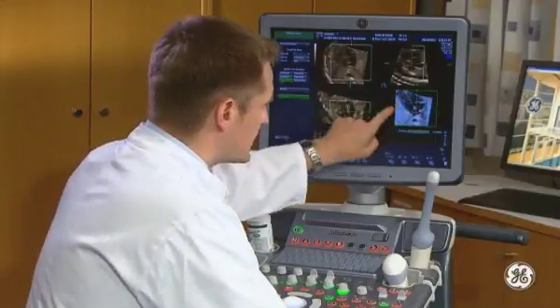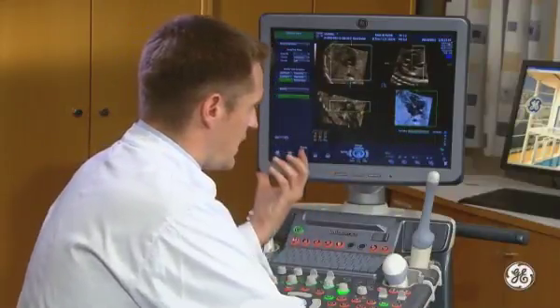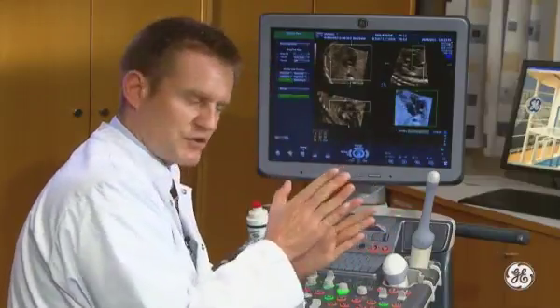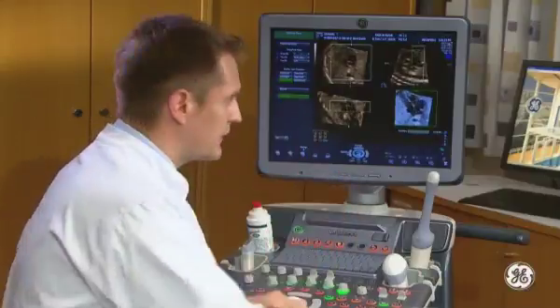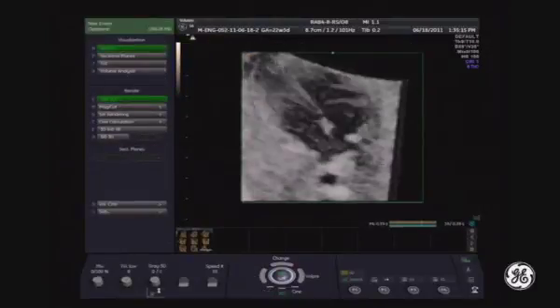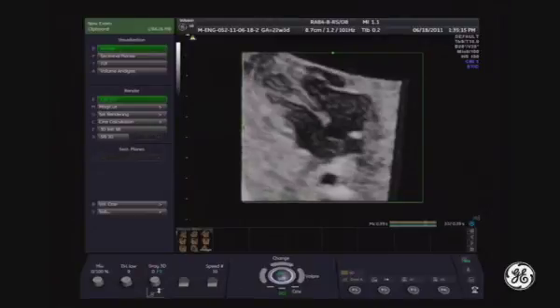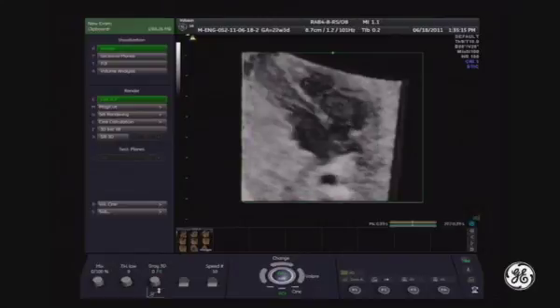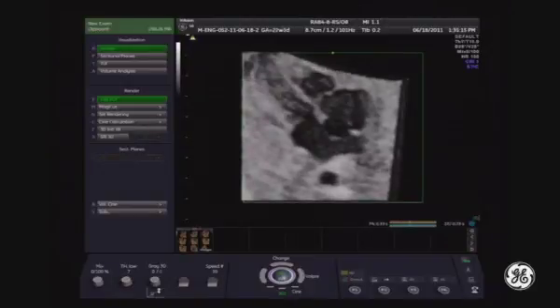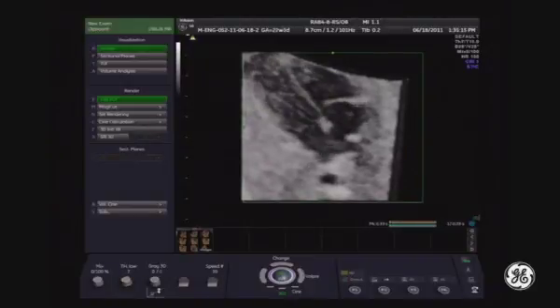So instantly you can see the perspective. You can see that this is a three-dimensional reconstruction in the small region of interest. And you can bring it to the full screen, like this. Here I use the rendering algorithm which is called gradient light. And you should be careful about the threshold low levels. We keep them quite low. Here we have level 8, level 7.